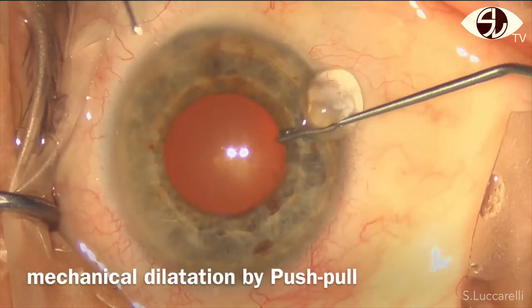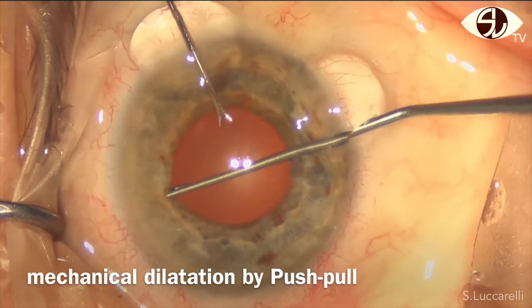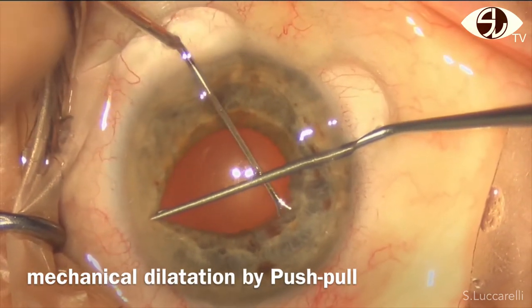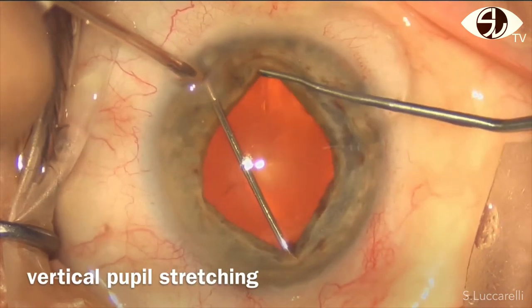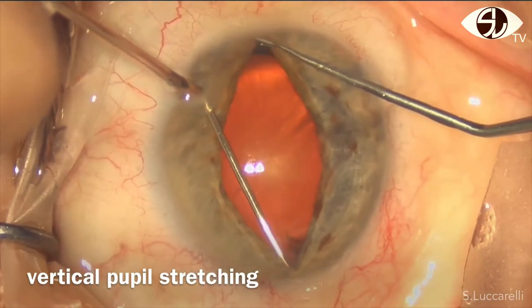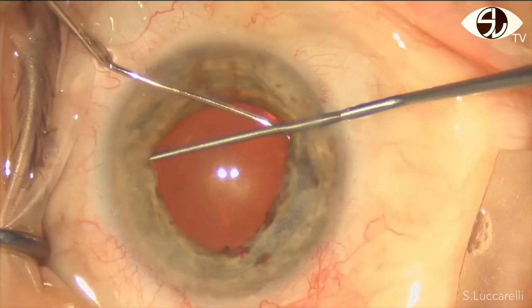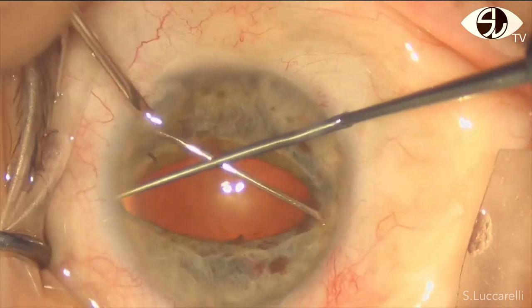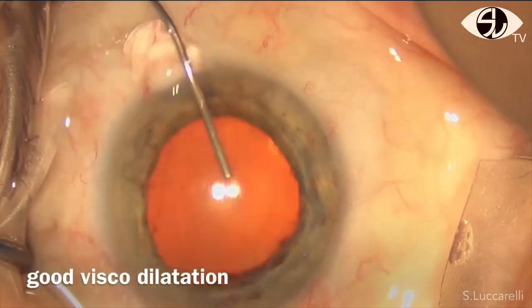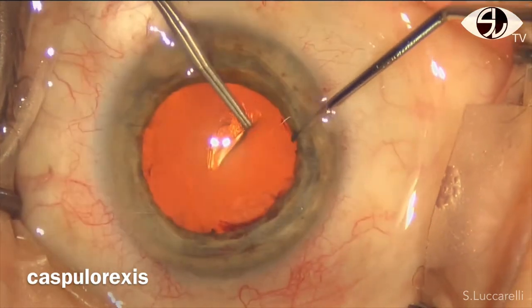Push-pull are used to engage the pupil and stretch the iris, horizontally, then vertically. Proper dilatation is obtained and a capsulorrhexis was performed.